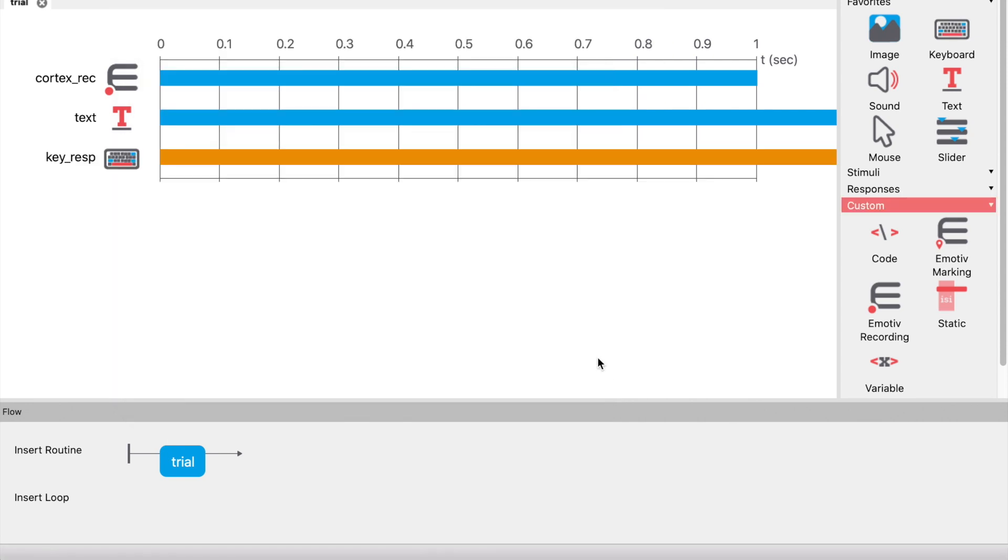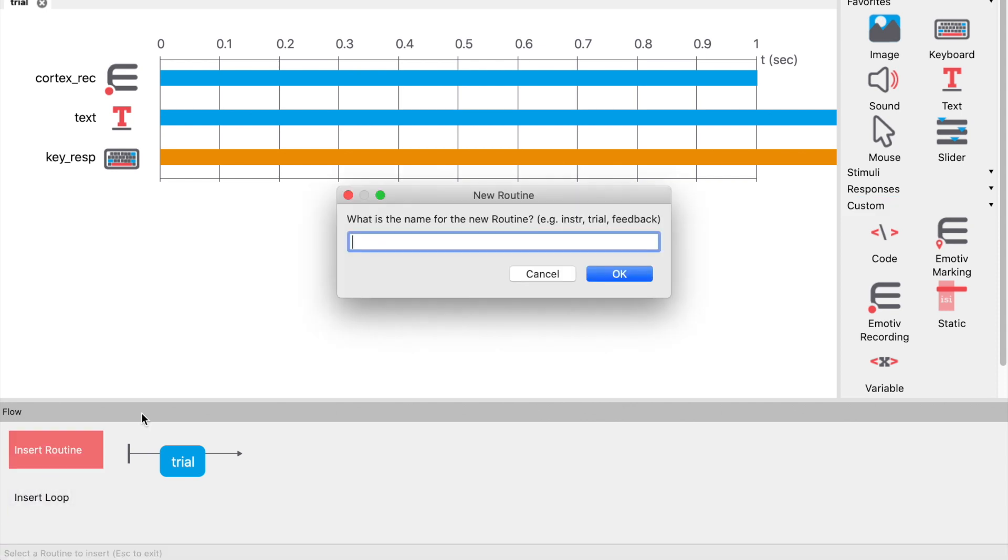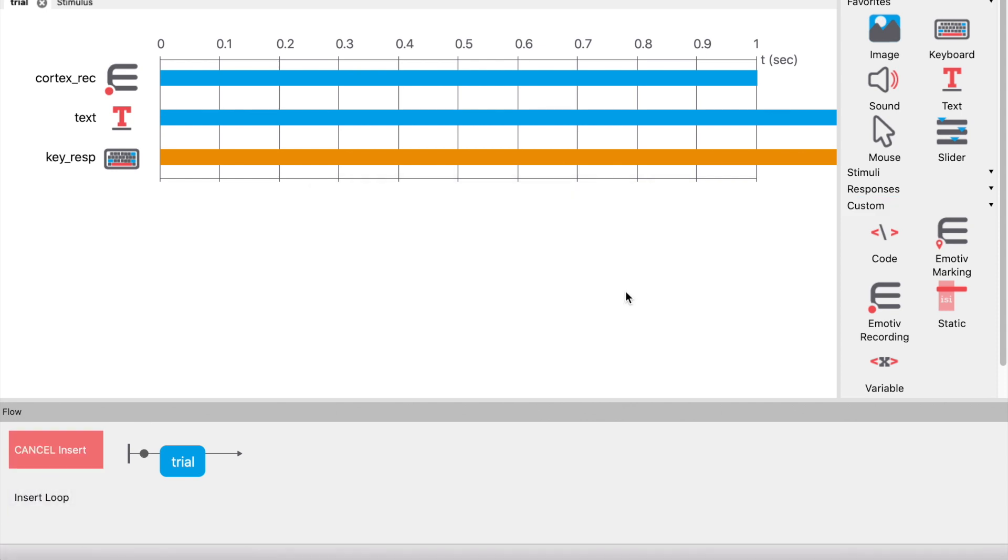Now add a new routine. Let's call it stimulus. This routine will present the stimuli and mark the data.